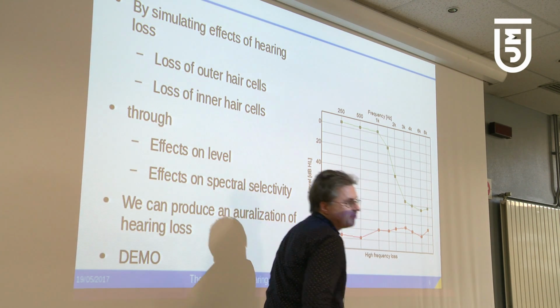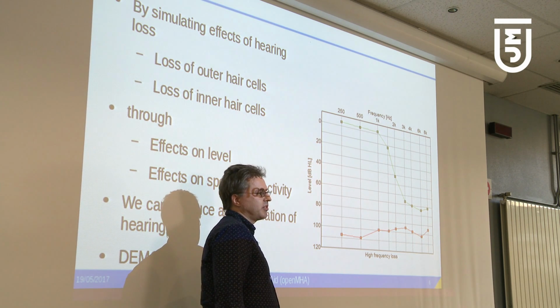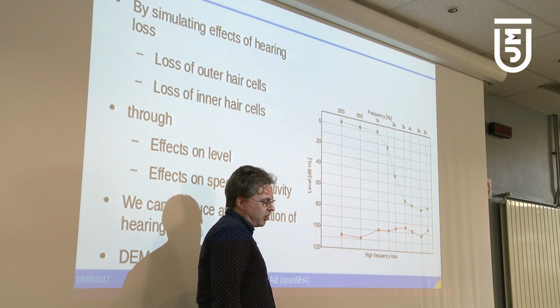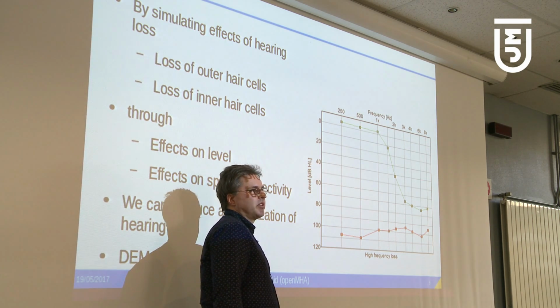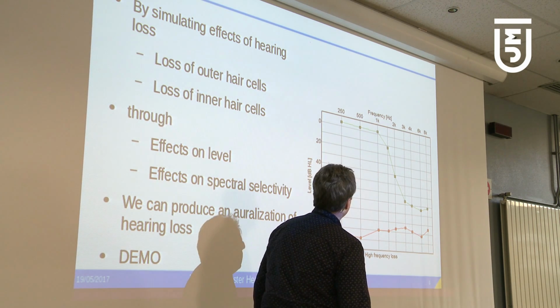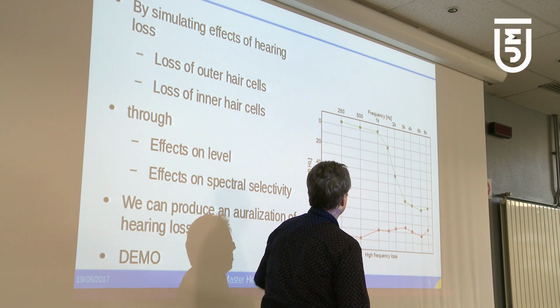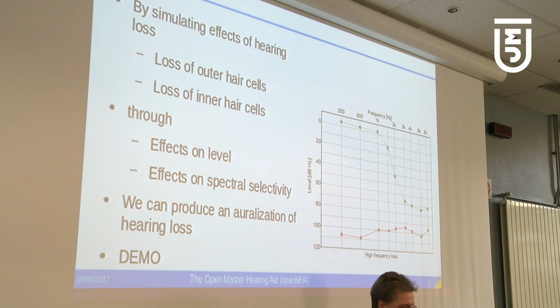And interestingly, for normal hearing people and for hard of hearing people, often uncomfortably loud is in the same range, in the same region. So when you get a hearing loss, you don't necessarily have elevated uncomfortable levels.